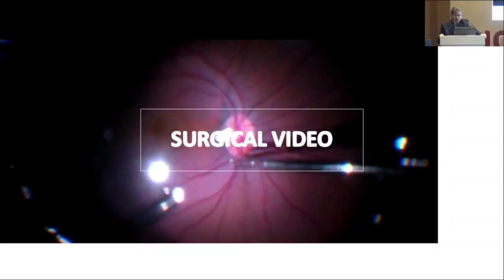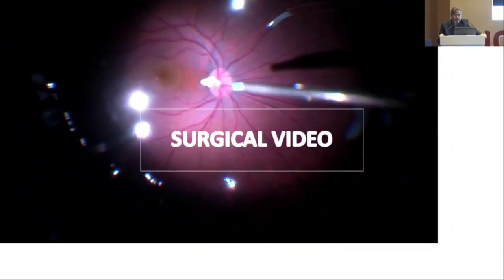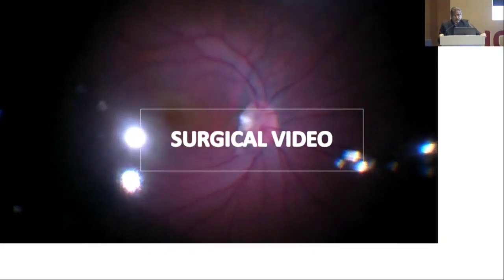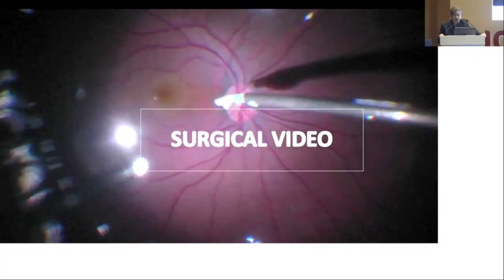Initially we were afraid because of damage to the optic disc and circulation, but now we are confident of putting this scleral plug. We have to identify the size of the optic disc pit before inserting it, because we require watertight closure. We have done ILM peeling, but ILM peeling is not sufficient; it does not stick to the optic pit.